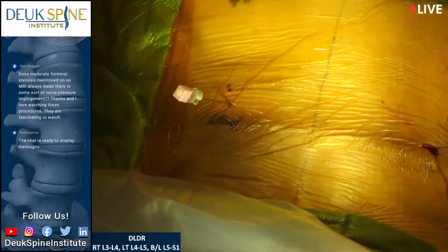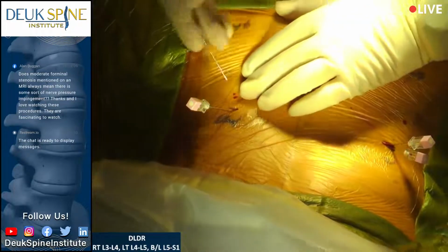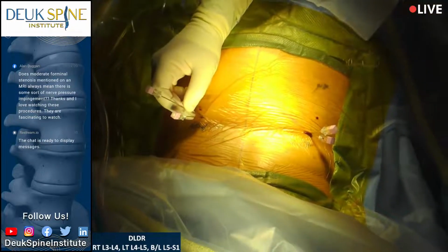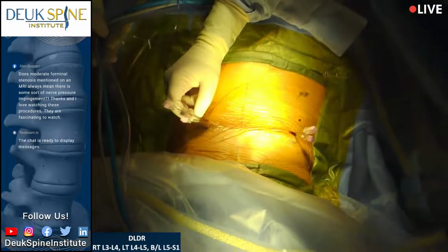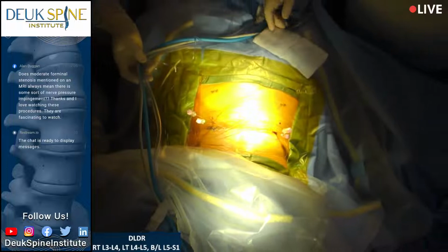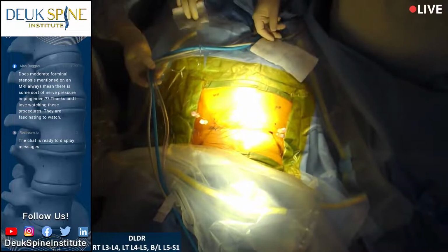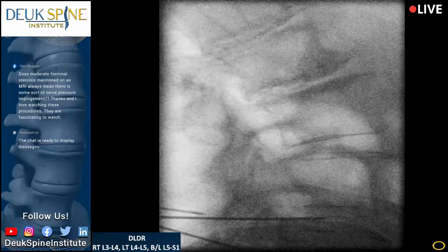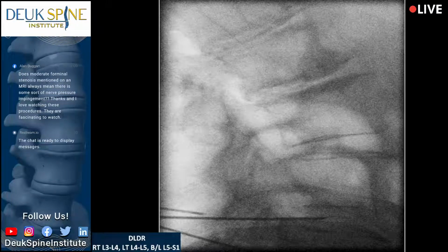All right, so I've done what I can on the right at 5-1 in terms of positioning this needle optimally to where I need it to be to gain access to the herniation to fix it endoscopically. So now I'm going to go after the 3-4 disc. Right, 3-4 is next. You agree? Agree, sir. So let's get a better fluoro picture. All right, we've got to do better than that, I hope. Shot.